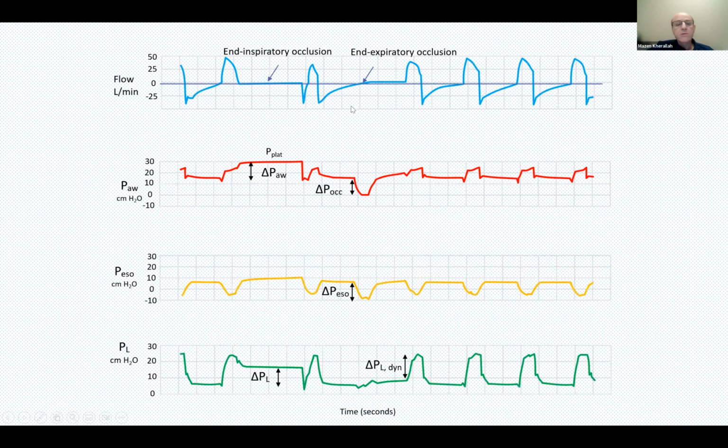I have both done on one patient here, and I'm not going to go into details. We're going to dedicate special sessions, but I'm going to introduce the concept of the inspiratory occlusion maneuver. If we occlude the inspiration, the peak pressure goes up from the peak to a higher pressure, which is the plateau. As you all know, the plateau is lower than the peak pressure.